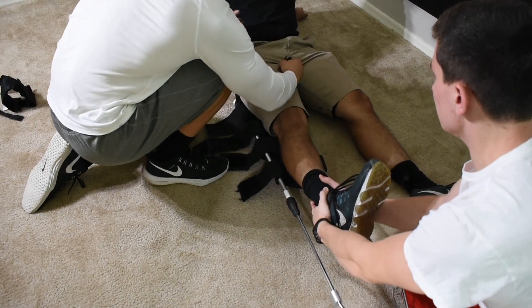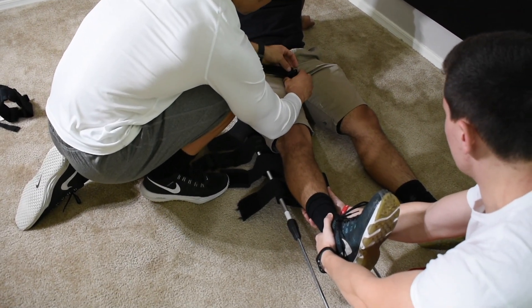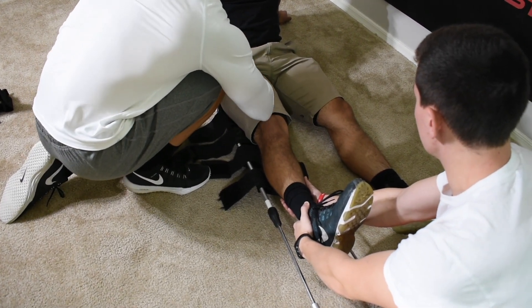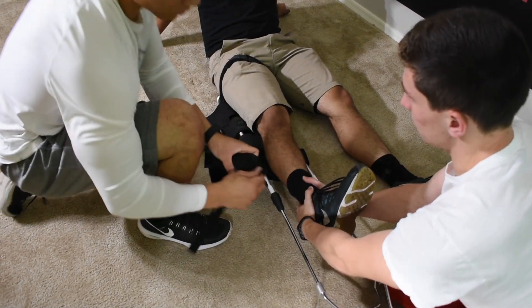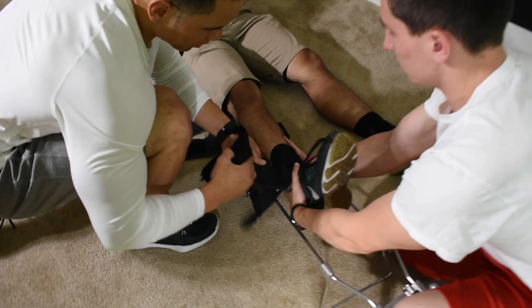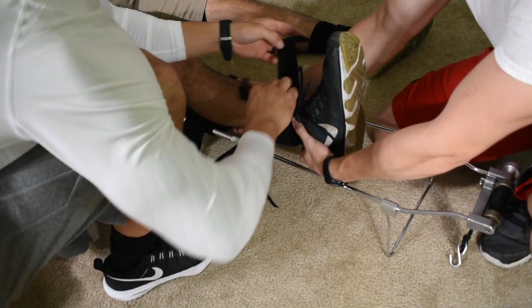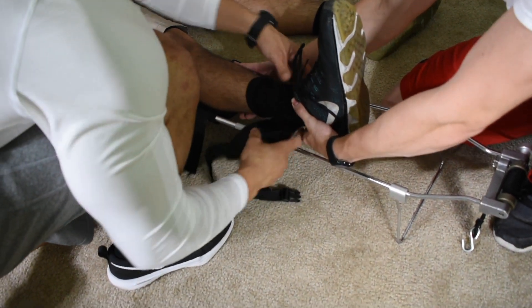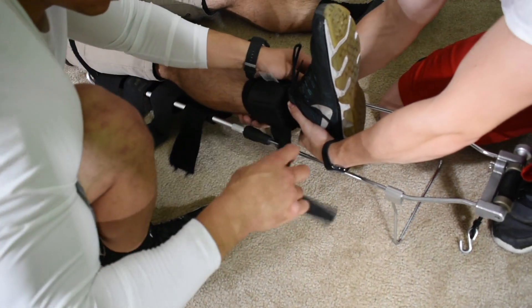First I want to apply the hip strap. Now I'll get my ankle strap. I'm just going to work with you here — ankle strap.